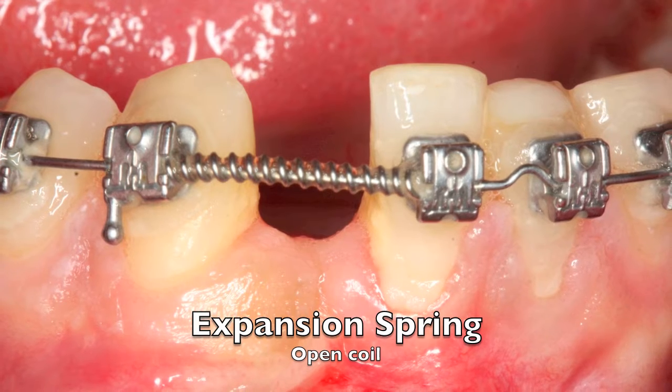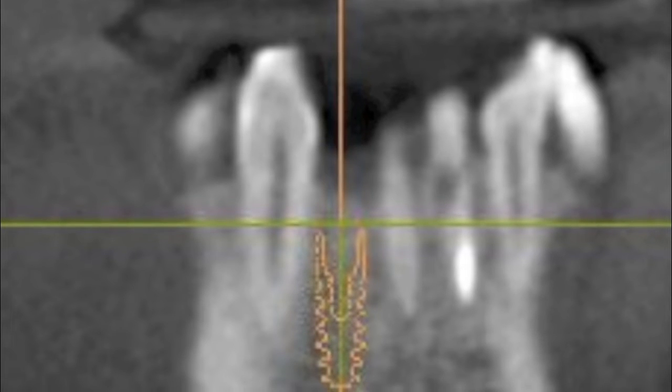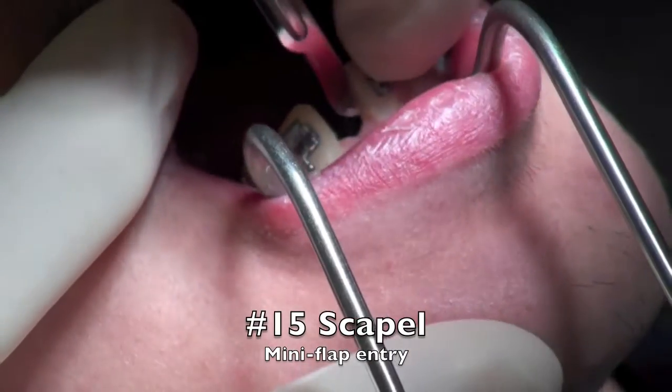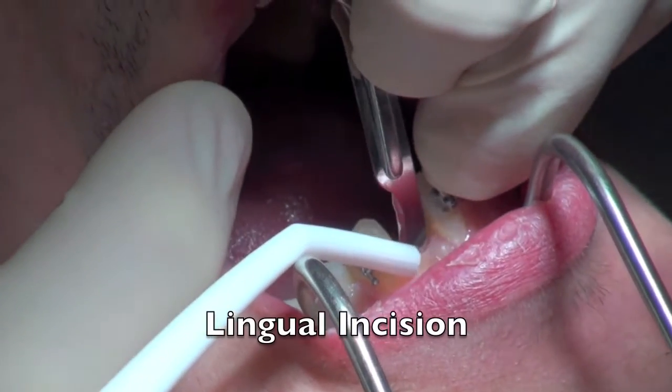Even after orthodontics, the lateral position on the lower is very challenging for implants. You can see the mock-up of the 3.5 is still pretty tight. So the 3.0 millimeter implant is actually quite an exciting alternative in this area because we're able to get that into a very, very small space.